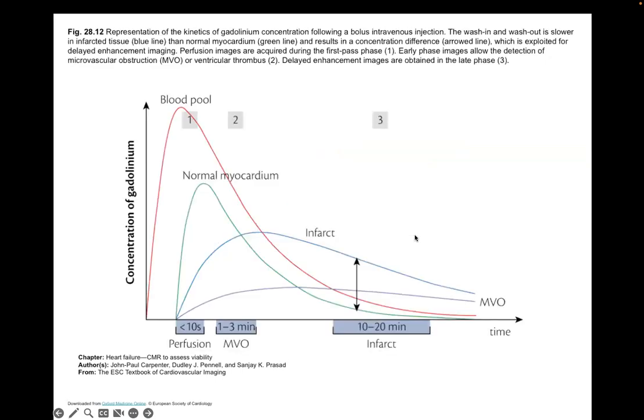And when we look at it, so here's the blood pool after injection of, this is time in this direction, and we're going to inject gadolinium contrast. It's called gadolinium DTPA, and it's injected in a vein, just like CT contrast. And the signal in the blood pool goes up precipitously. It has high contrast, and then it decays away as the contrast sort of goes out into the kidneys, etc.